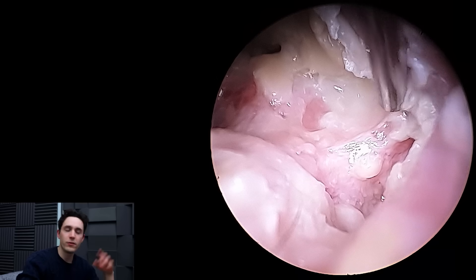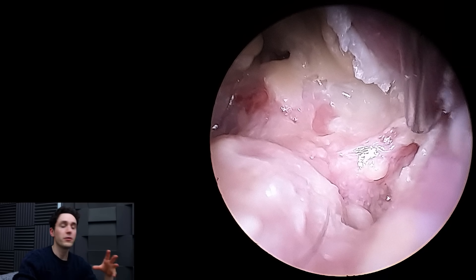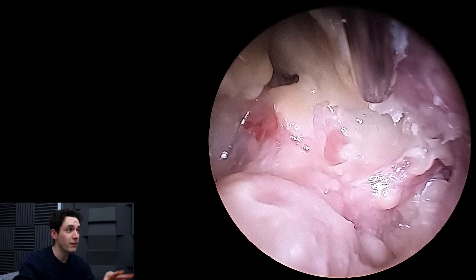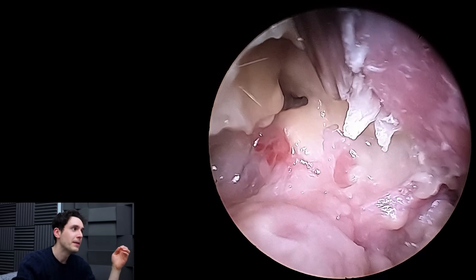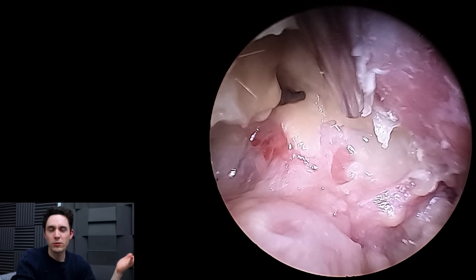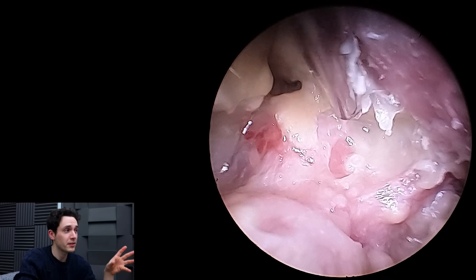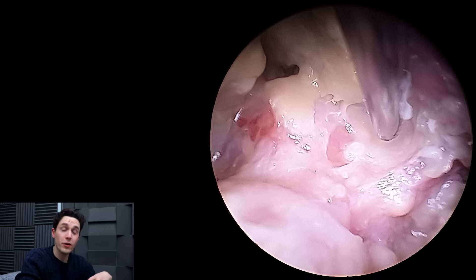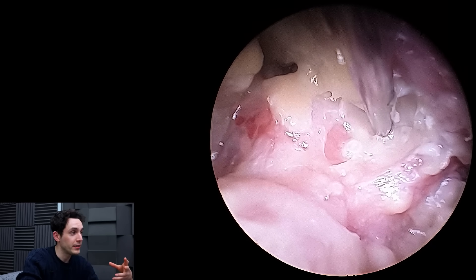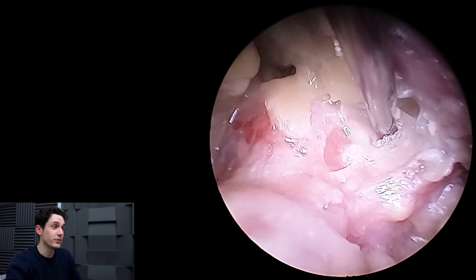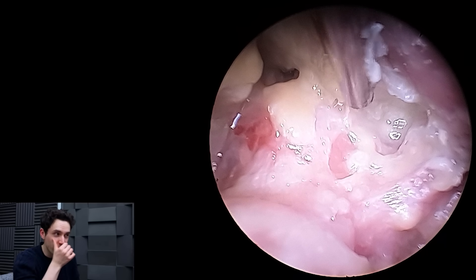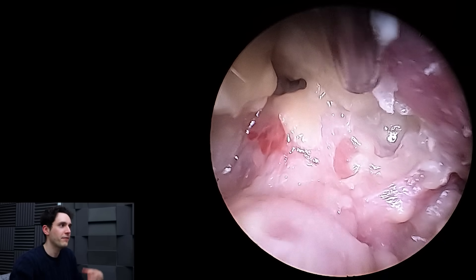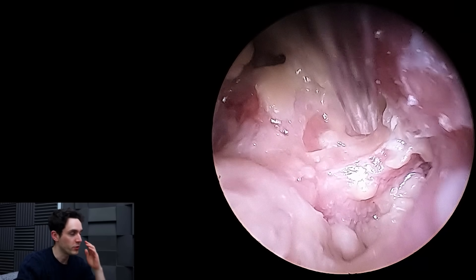If you're looking into this ear and you're thinking, I don't know what the heck I'm looking at — that's okay. Because unless you're an ENT surgeon with a particular interest and talent for doing mastoid operations, I think most people, doctors or non-doctors, would look at this ear and think the same. Mastoid cavities, although difficult to navigate and clean, I actually quite enjoy cleaning them because it's challenging, and you don't really know the perimeters of normal anatomy. So carefully, slowly is the modus operandi here.